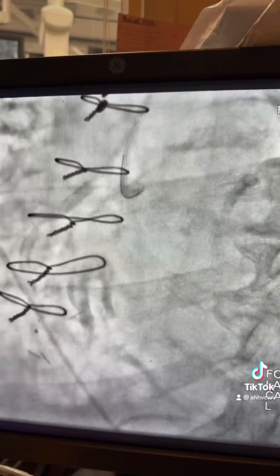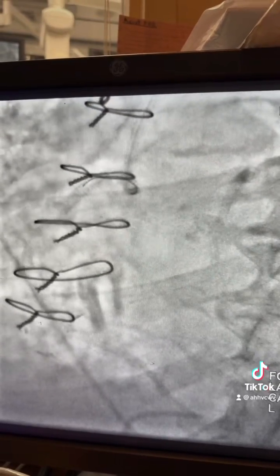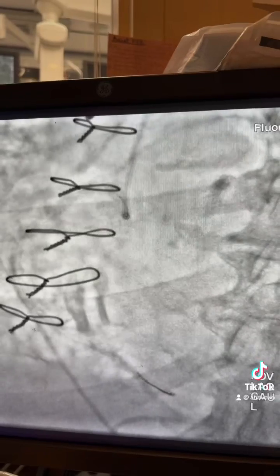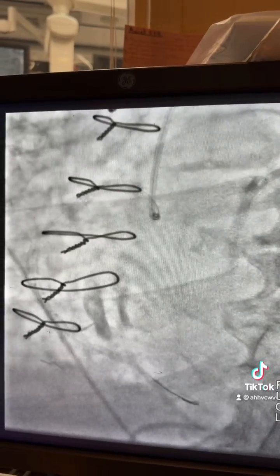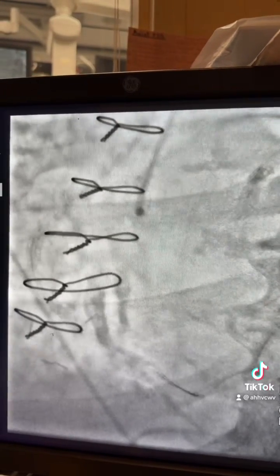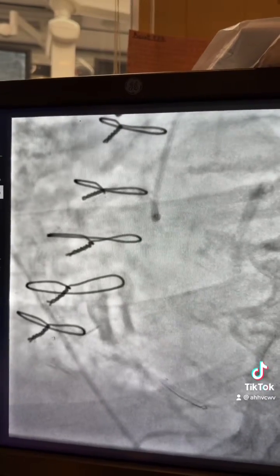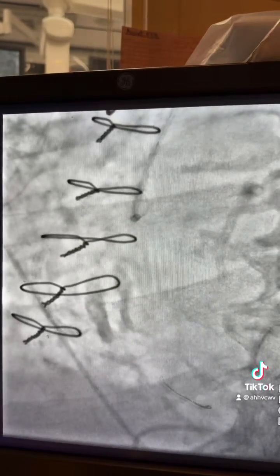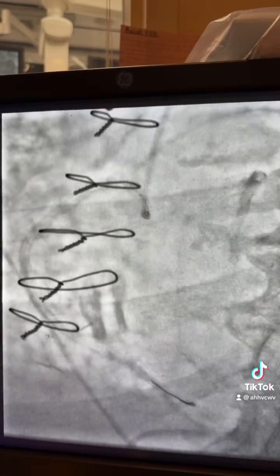After that, you try the balloon again — and you see the balloon, even the bulky balloon, went through smoothly. This is the Shockwave balloon, 3.5 millimeter.